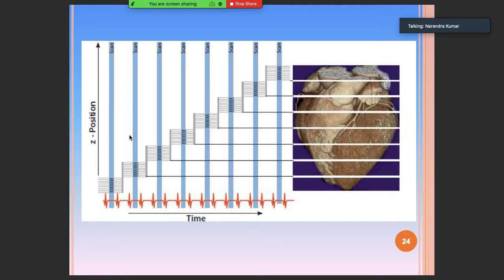So, one simple question. We are aware that one heartbeat has to be skipped between every scan of the usual clinical examination at heart rates between 50 to 90 beats. And so, how much? Okay, I'll just let it go.